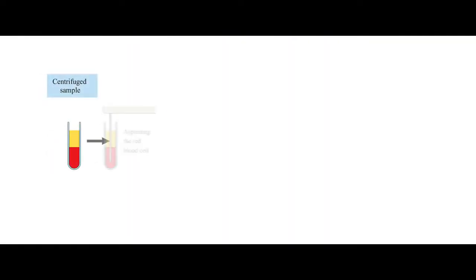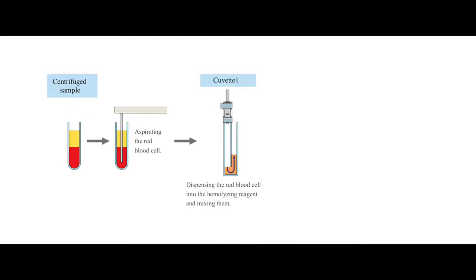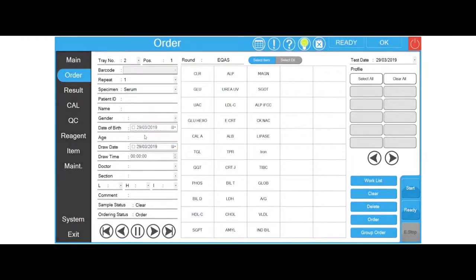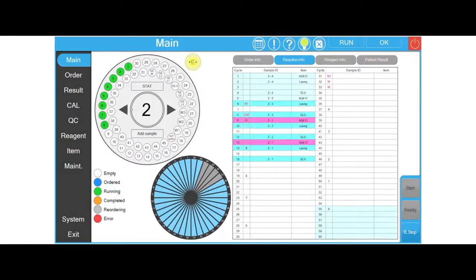TMS-30i can also be used as an HbA1c analyzer at your laboratory. It can accept sample cups with whole blood and vacutainers with centrifuged blood sample. On-board auto-hemolyzing procedure enables direct HbA1c processing from the primary tubes or sample cups.